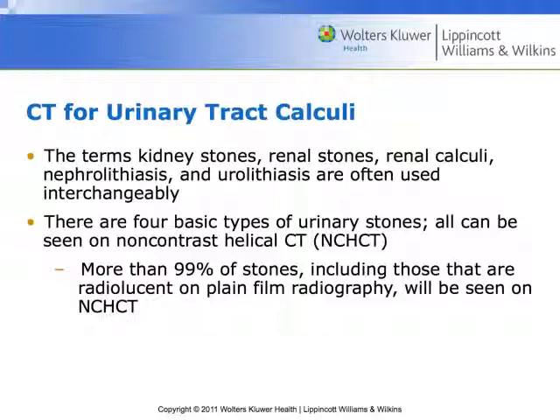And more than 99% of stones, including those that are radiolucent on plain film X-ray, will be seen on non-contrast helical CT scanning. So these are the guys who come in at 3 o'clock in the morning on Sunday night, and they feel like they've been stabbed in the back with a knife, and something was apparent on X-ray, or maybe they were just referred directly to CT for a renal stone protocol because there was hematuria.